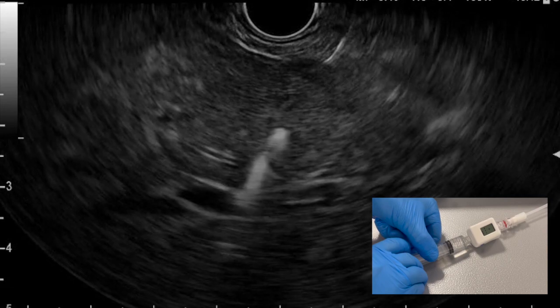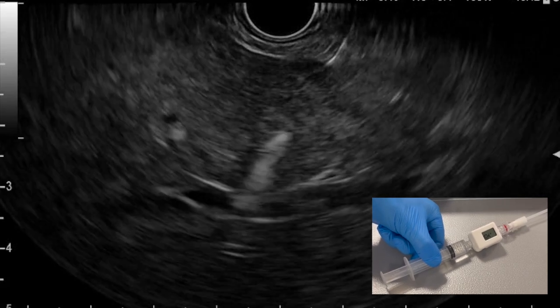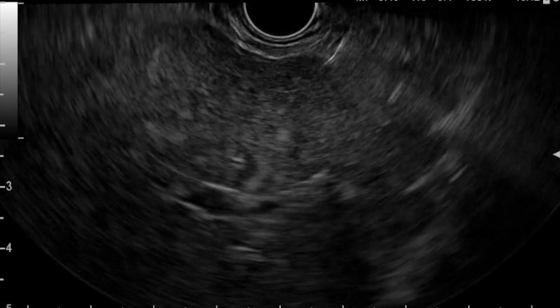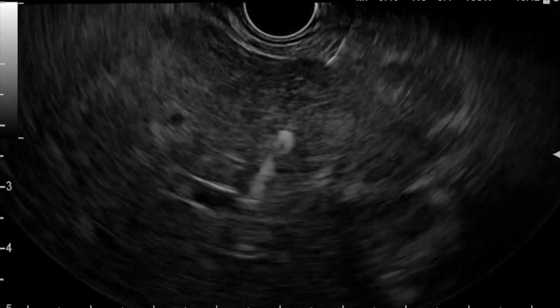I personally aim to minimize the number of hepatic surface punctures to reduce any risks of bleeding, and therefore tend to only take 1 puncture each of the hepatic vein branch and a further puncture of the portal vein branch. Once assessed and in a stable position, the needle should again be flushed with 1 ml of saline, removing any tissue debris or clot.